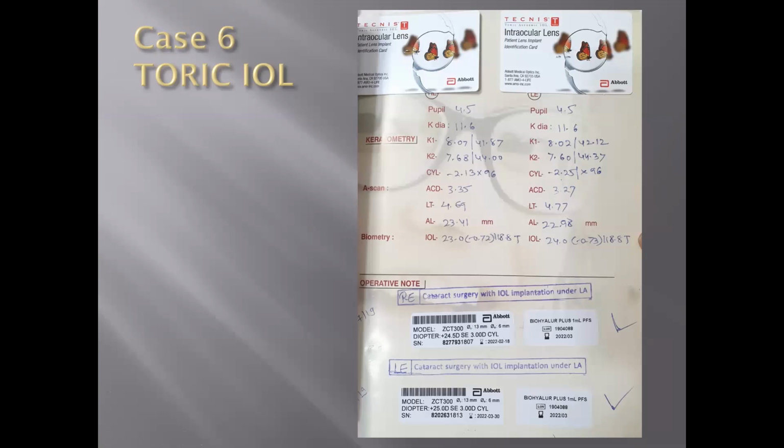So when a patient comes to you, if the patient does not bring any file with him, you will not be able to know whether the patient is implanted with a toric IOL, or a monofocal or spherical IOL, or an aspheric IOL. So here both things are important. I have selected this case for toric purpose only. Similarly, multifocal cases can also come to you. In that patient also, unaided visual acuity monocular and binocular, and unaided near visual acuity binocular is very important. That will guide you that the patient might have been implanted with a multifocal IOL.